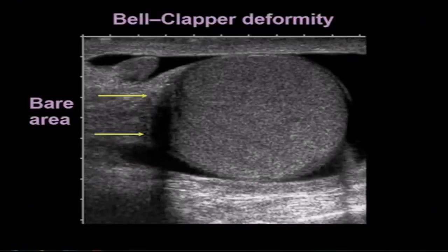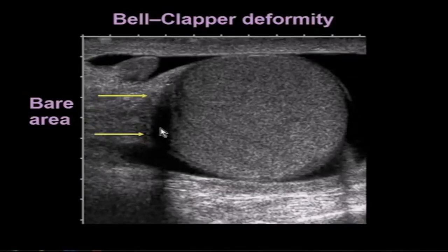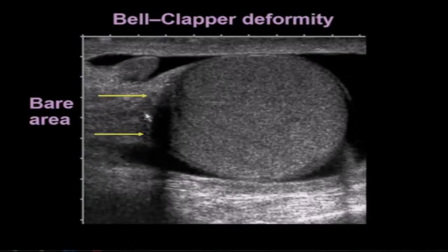This patient has a bell clapper deformity. You can see there's a small hydrocele — fluid in the scrotum around the testicle — allowing us to see the entire bare area for this testicle, which is quite narrow. This is the only attachment of the testicle to the scrotal wall, so it could twist on itself, particularly in the presence of this hydrocele.